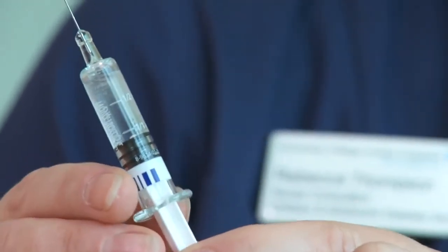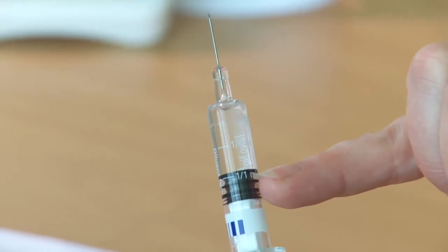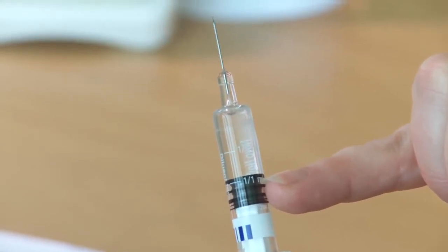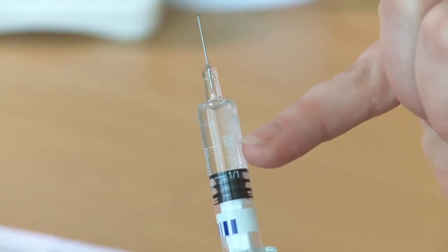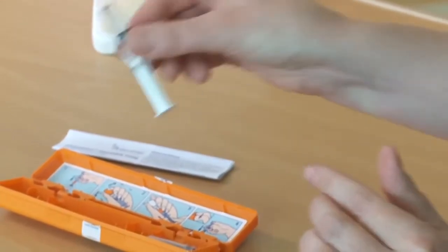There are two doses of this medicine that you can give. You can see on the syringe that there are two markings. For a child over 12 years, they need all of the fluid in the vial. If your child is under 12 years, they only need half. Today for this demonstration, I'm going to pretend we're doing it for a child older than 12, so we're giving the full dose.